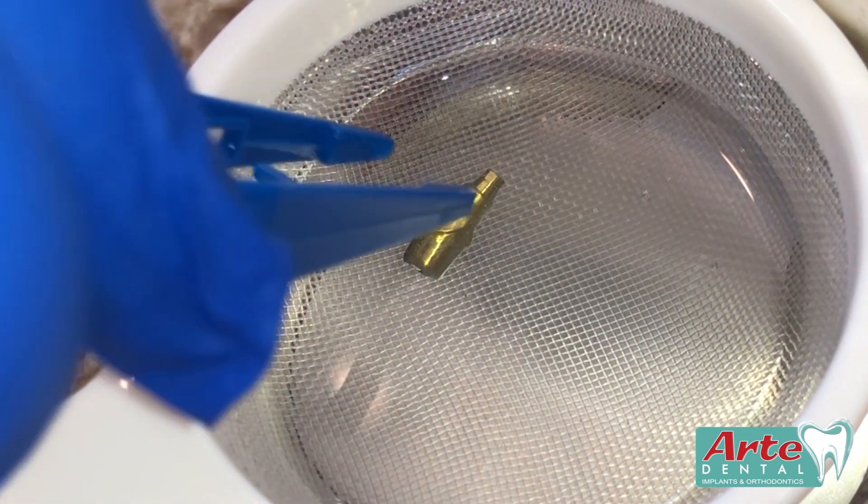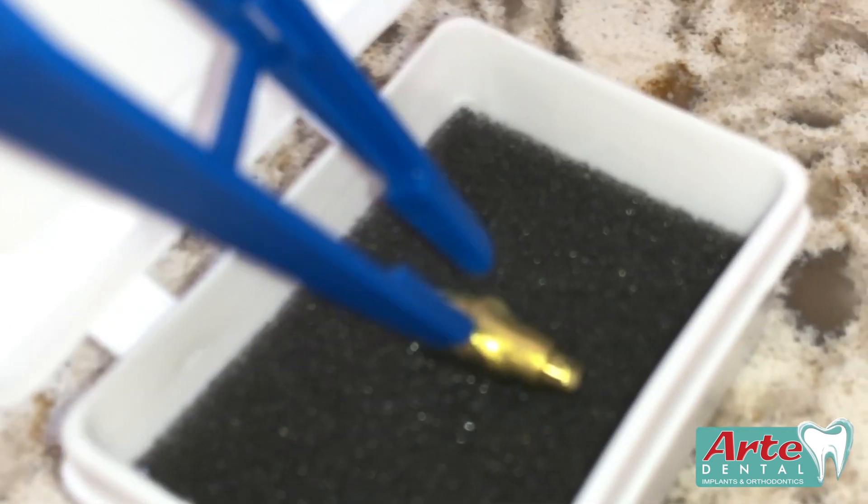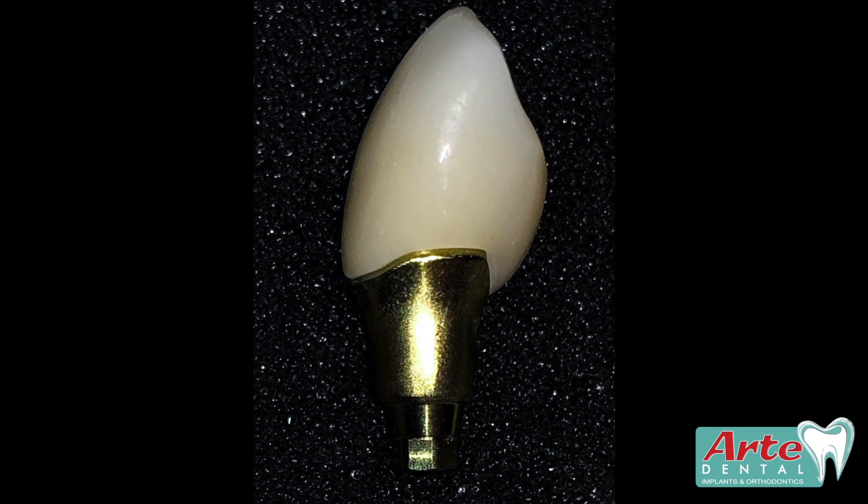We'll go ahead and remove that and drop it back into its little case that our abutments come in. Gold abutment.